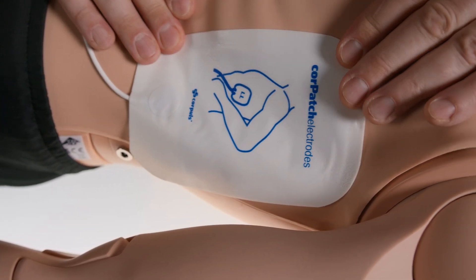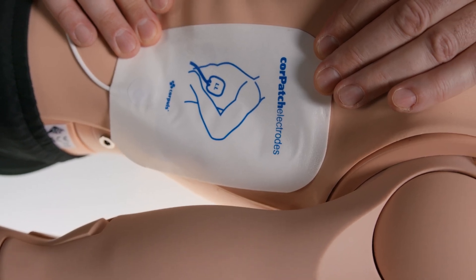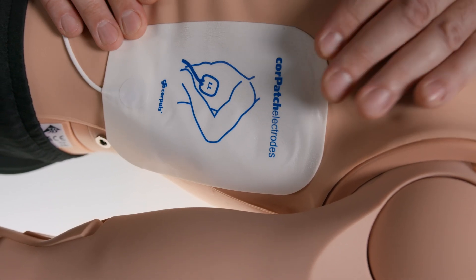When applying the electrodes it is important to make sure that there are no air pockets beneath the adhesive surface. Additionally, implanted medical devices should be avoided.